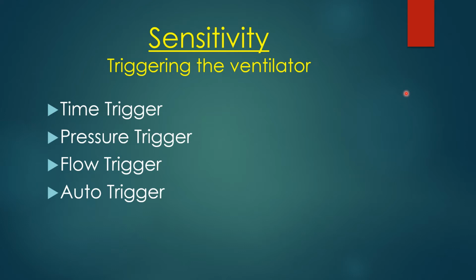It also can cause air trapping, so the patient may not finish exhaling when the next breath is auto-triggered. So we need to be careful about auto-triggering and be able to recognize it. Sometimes it's not real noticeable, but the machine will tell you every breath that is triggered by the patient. So you can look and tell which breaths are patient triggered and which breaths are machine triggered.